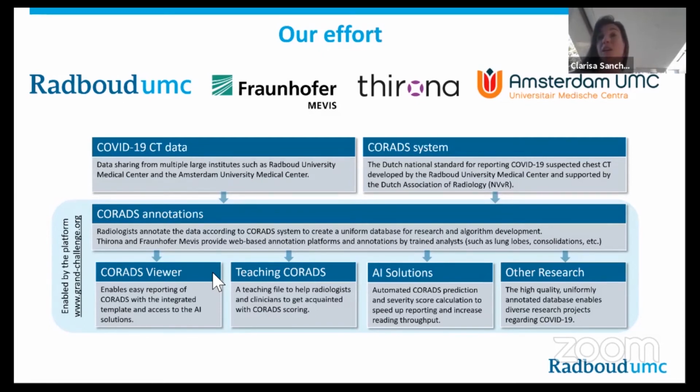And we are also focusing on creating AI solutions that can be incorporated in this viewer, focusing on the prediction of CO-RADS scores and also severity scores in order to speed up the reporting. And finally, the other sub-goal is to try to create curated databases in order to provide to the community through a challenge, so we can join efforts on solving this problem of automating the CT reading.